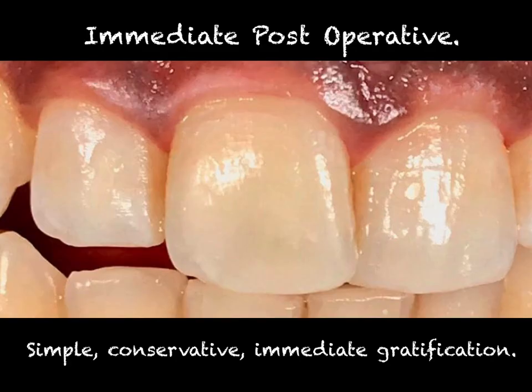That was our immediate post-op result, friends. It takes about less than 10 minutes to complete the entire cycle with the maximum results possible. It's simple, conservative, and the patient had immediate gratification.